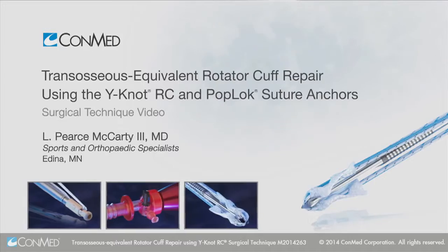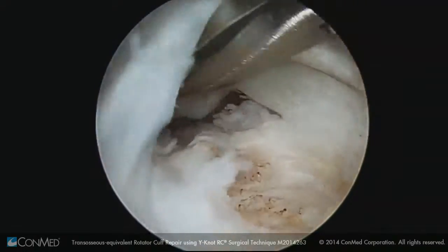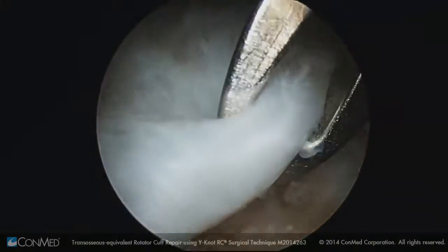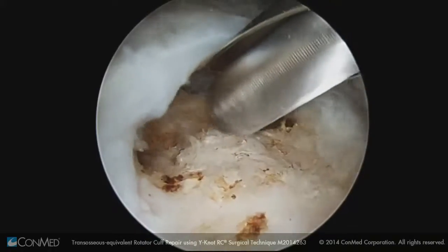Hi, this is Dr. Pierce McCarty from Minneapolis, Minnesota, and today we're going to look at the use of the 2.8 millimeter Y-knot RC to repair this crescent-shaped full-thickness tear of the supraspinatus. We're going to use a transosseous equivalent technique.